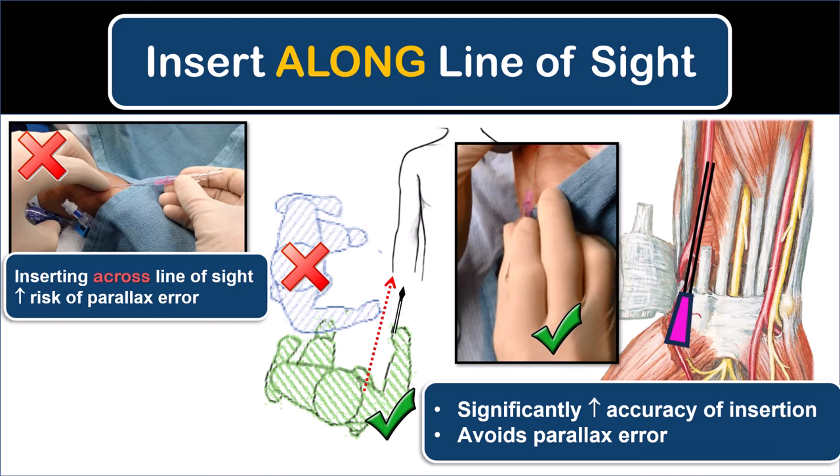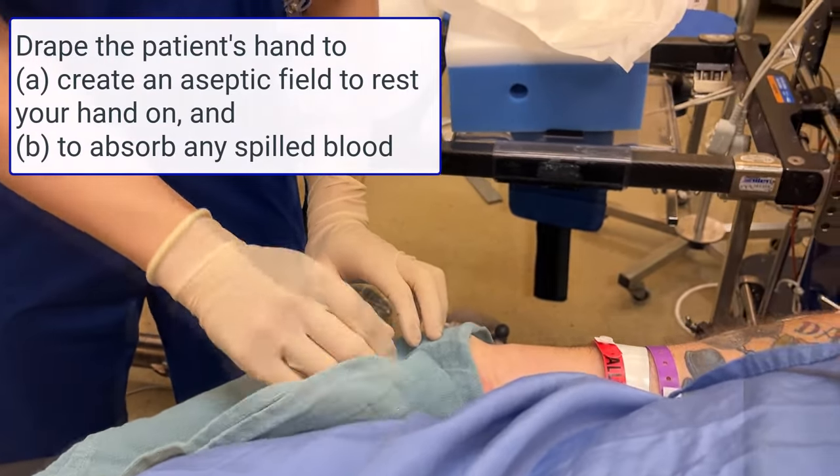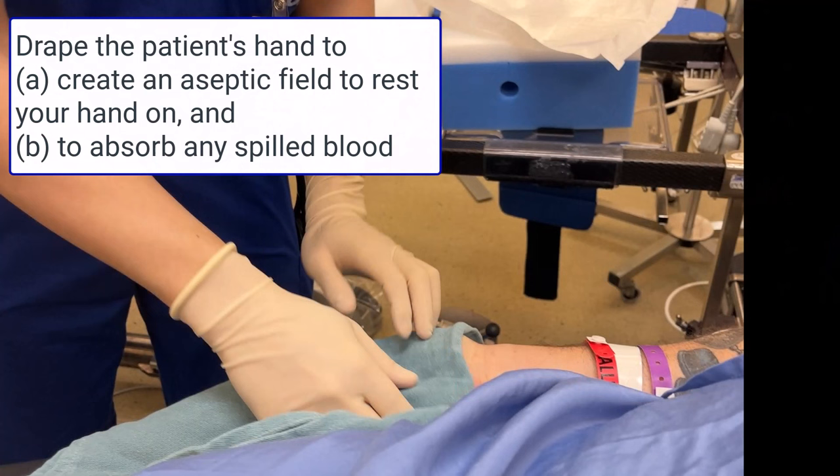As an aside, this same principle also applies to accuracy of in-plane needle beam alignment in ultrasound-guided nerve blocks and vascular procedures. After sterilizing the skin appropriately, place a sterile towel over the patient's palm.